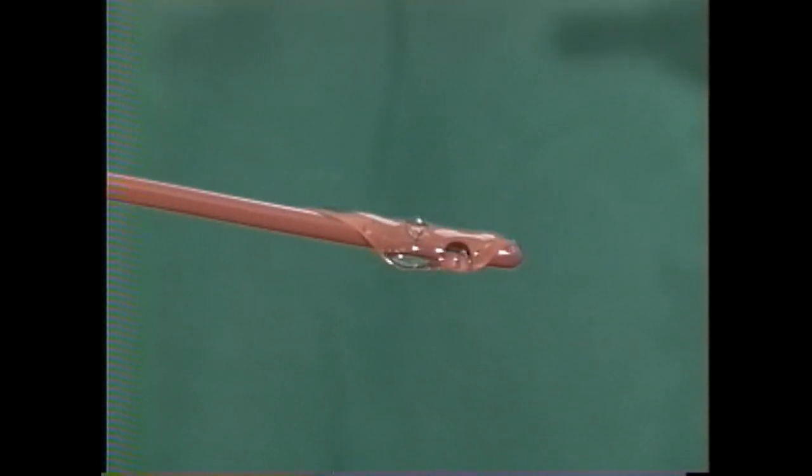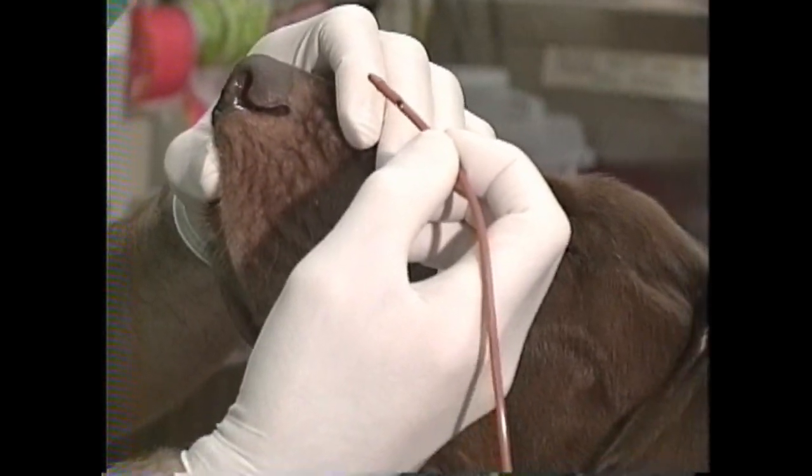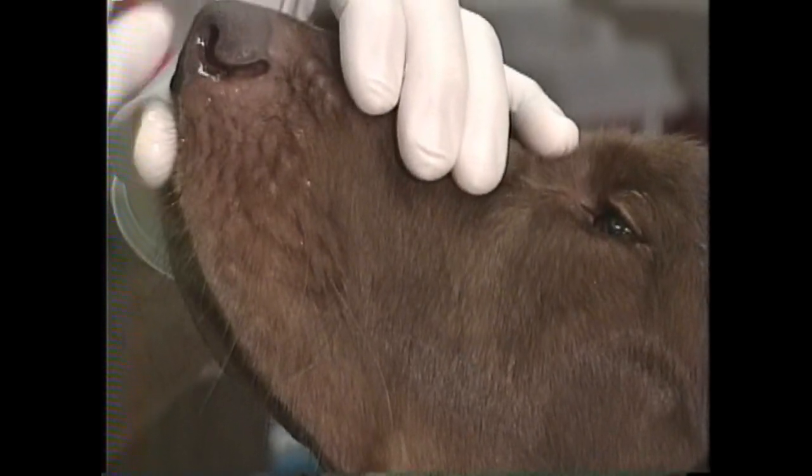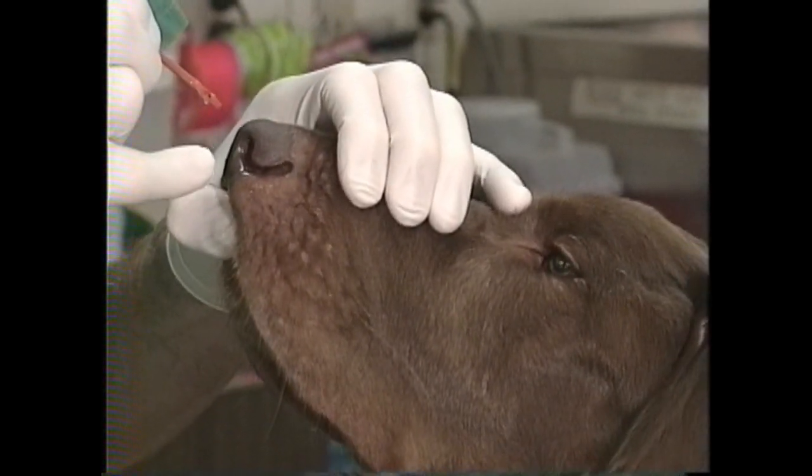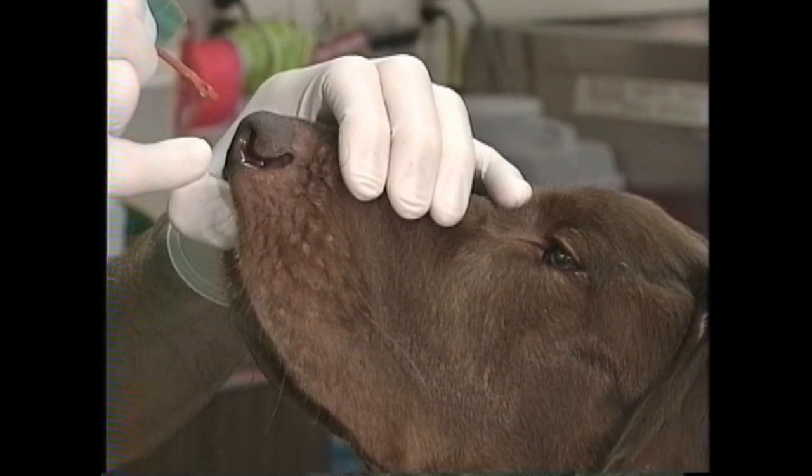After two or three minutes I'll lubricate the catheter with the 2% lidocaine lubricant and prepare to place it. This is the key part of the procedure because the tip of the catheter has to go underneath the middle turbinate. To achieve that I'm going to push the nose up with my left thumb, push down on the soft tissue of the nasal plane with my left index finger, and direct the catheter ventral, aiming it to the first incisor on the ipsilateral side.